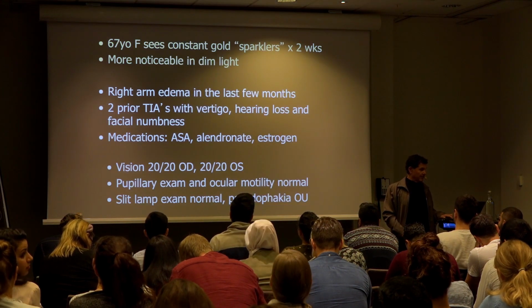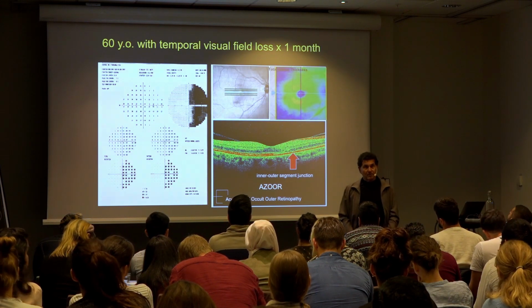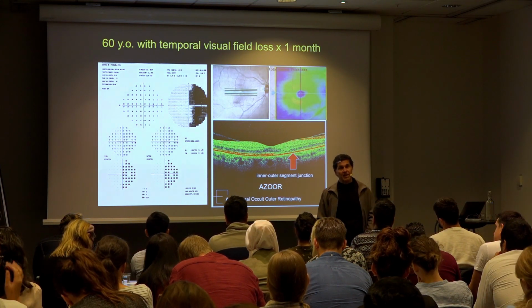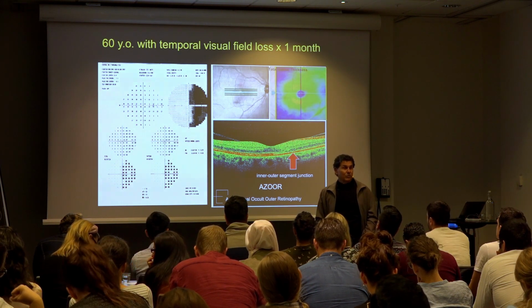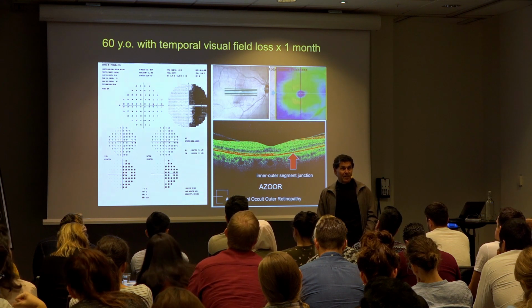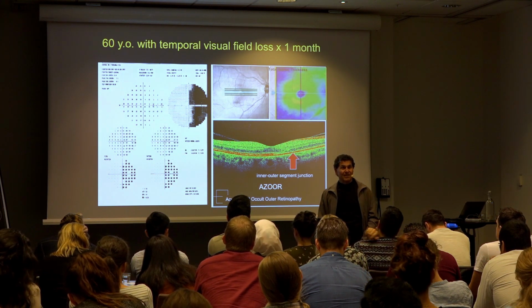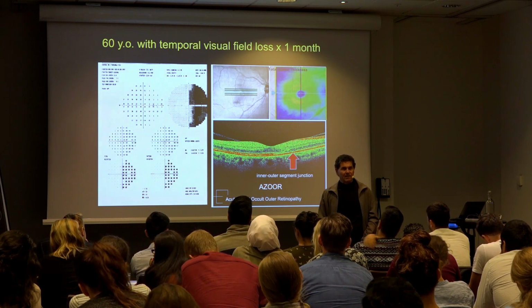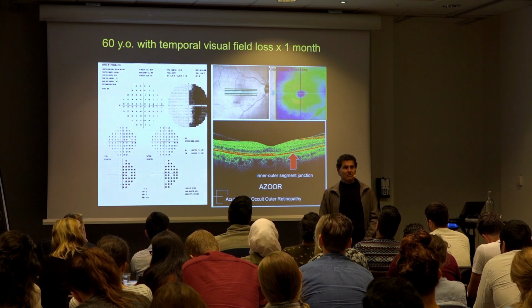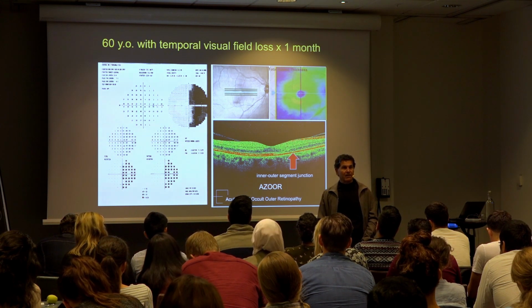I have a question there. Are these patients, do they have a relative afferent pupil defect in this eye? Yes, they do. Because remember from the lecture this morning, yes, we've got melanopsin ganglion cells, but they also are activated by photoreceptors, right? And so that old adage that you don't get an RAPD with asymmetric retinal problems is not really true. You do get an RAPD.